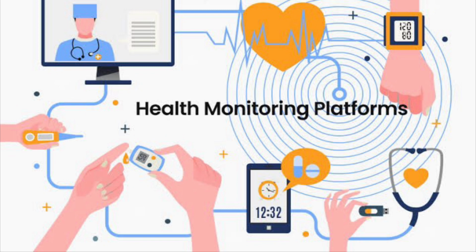So once you've identified what is the need for starting a wearable continuous vital signs monitoring program, the stakeholders should be identified, and that falls into three main categories. One is from the administration and leadership. Somebody from the administration side has to take the leadership to study the problem and get it implemented. Second is to identify the staff required for this program. And third is to identify the category of patients for continuous vital signs monitoring in the hospital.